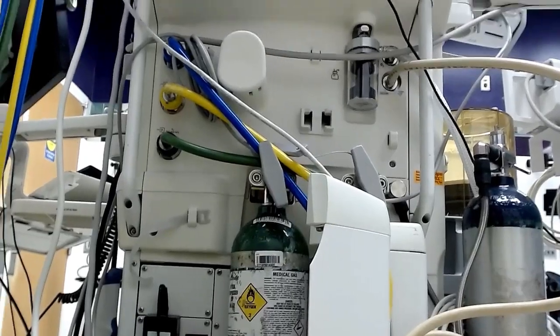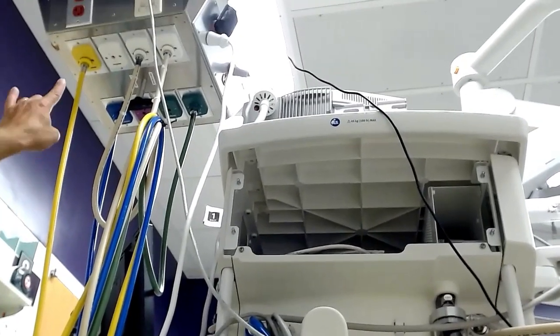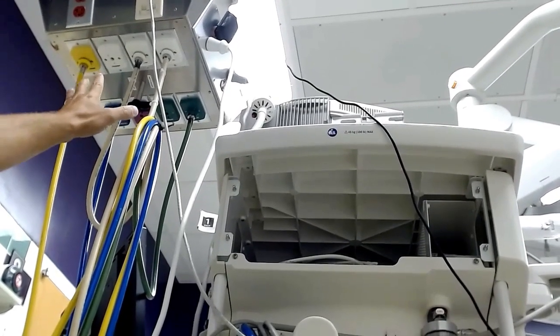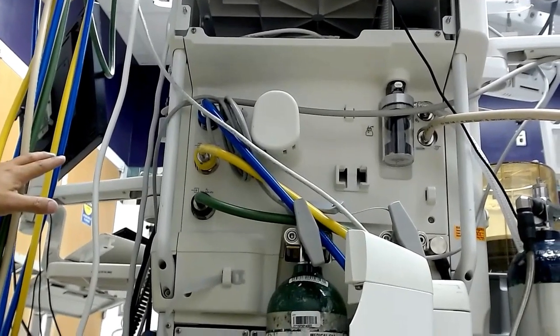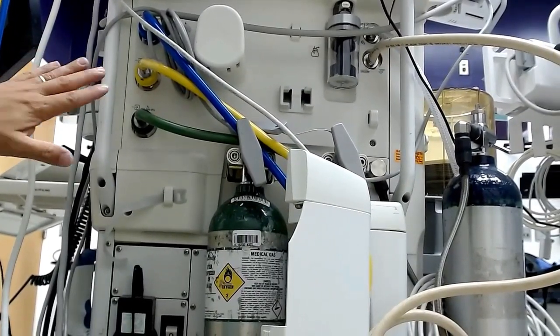I'm going to pan up here for just a minute, and what you'll see is where these wall units come from. So we have what's called a boom, and from the boom, you're going to have the lines that lead down, bringing oxygen, nitrous oxide, and air to our machine, and again, are supplied into our machine.